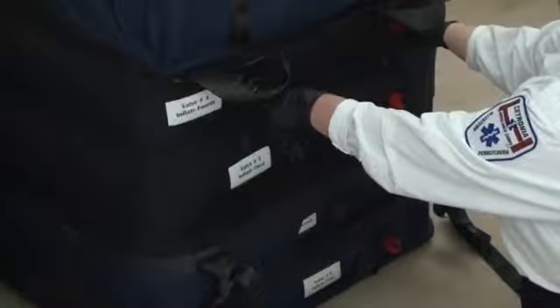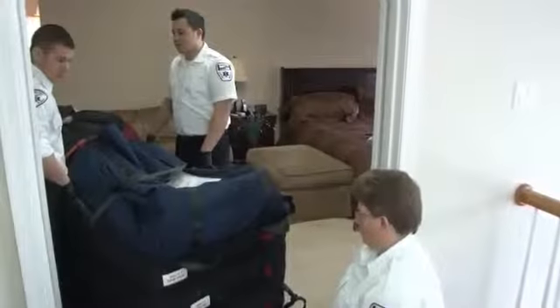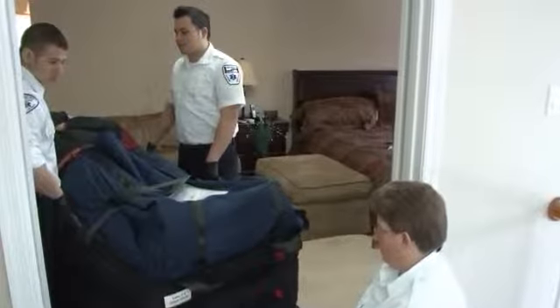Before descending the stairs, the top 2 chambers closest to the patient, chambers number 3 and 4, will need to be fully deflated. Crew members should be positioned on each side of the Evacuation HoverJack 2 when deflating the chambers to ensure a balanced and secure deflation. Chambers number 1 and 2 will remain fully inflated.